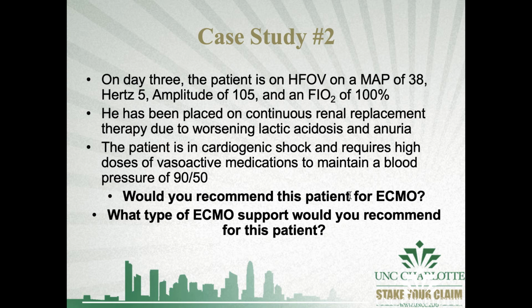So we went through the oscillator, pretty much how it works nowadays. You're going to probably transition to ECMO at some point. Probably should do one or the other earlier, but we're not going to go there. So this patient's in cardiogenic shock. He's on a lot of vasoactive drugs. Would you recommend him for ECMO? Based on his oscillator settings, absolutely, I would recommend him for ECMO. There's nothing good going to come out of this, and him in cardiogenic shock is going to end in death. Might end in death on ECMO, but who knows? So the key word here is cardiogenic shock.